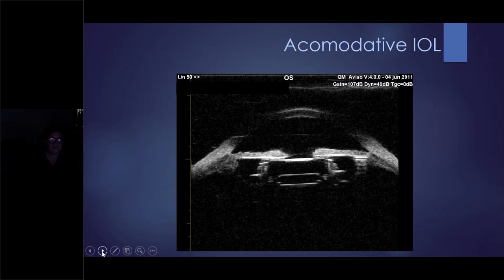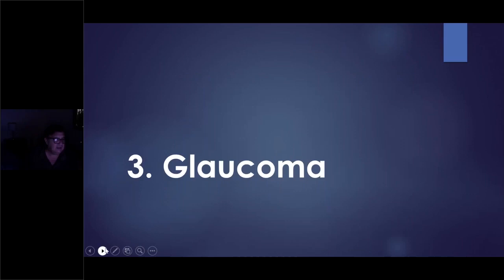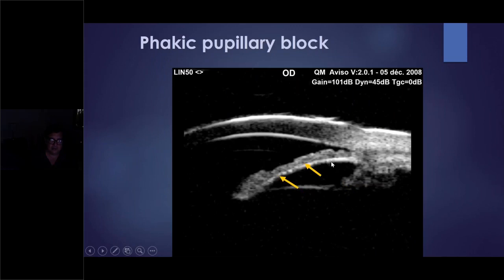Also, this is work that we did with accommodative intraocular lenses and glaucoma. You can describe pupillary block very well, and you know that in this case, iridotomy is useful. If you have pressure behind the iris and there is pupillary block, if you make an iridotomy, it works and the angle opens. But if you have another condition, plateau iris, another constitutional configuration of the angle, there is no reason to make an iridotomy.